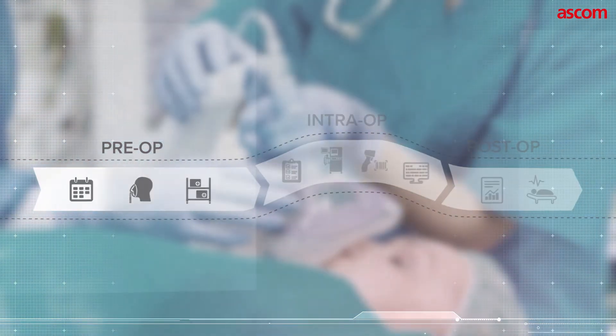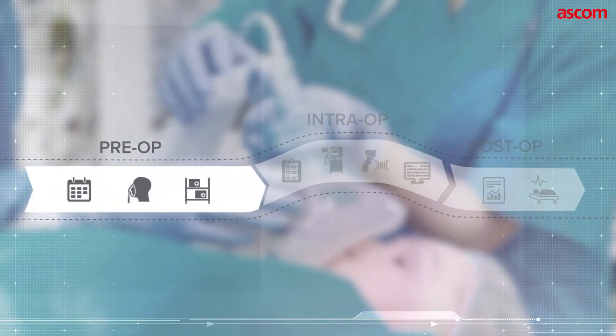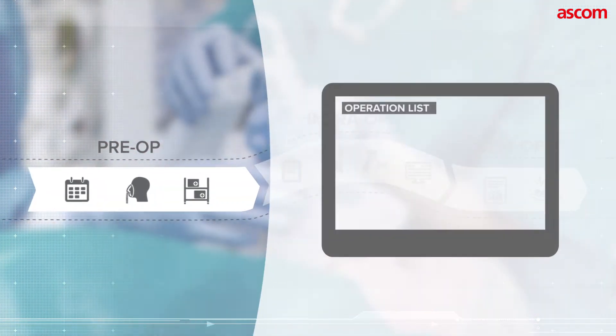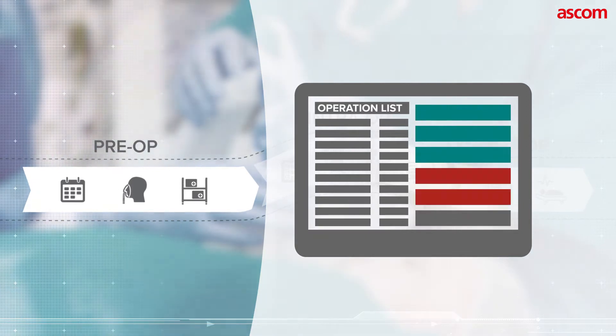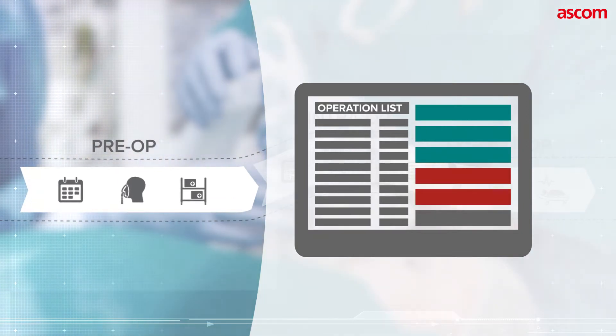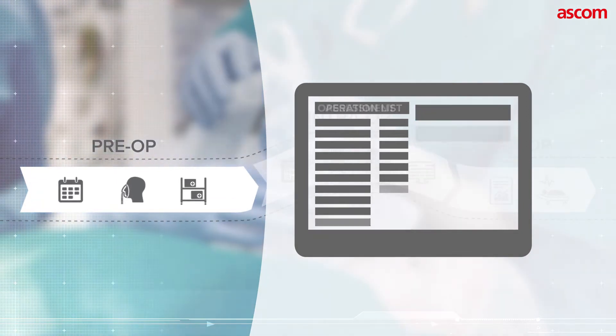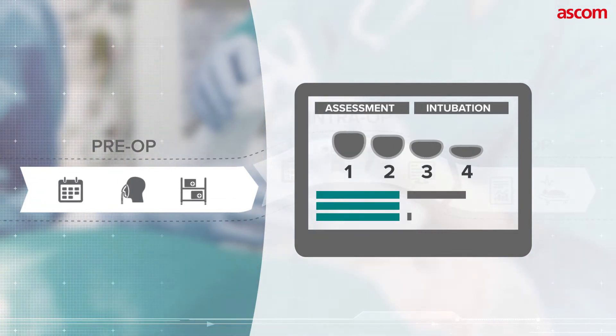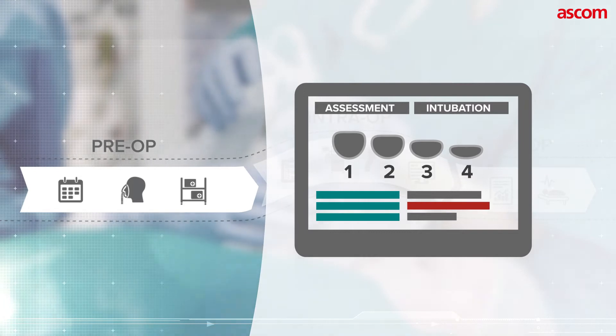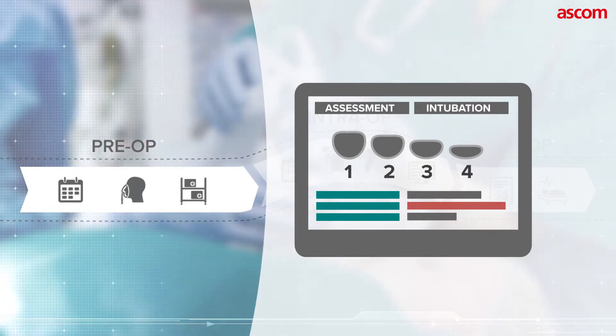In the preoperative phase, Digistat facilitates procedure scheduling, assists anesthesiologists with pre-assessment, as well as helps in material and resource planning.